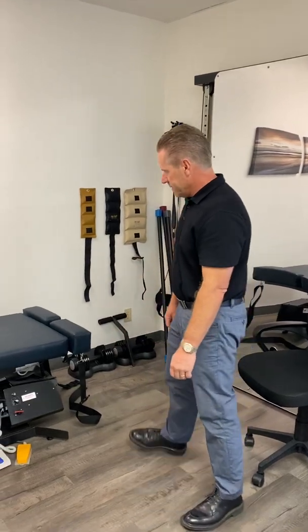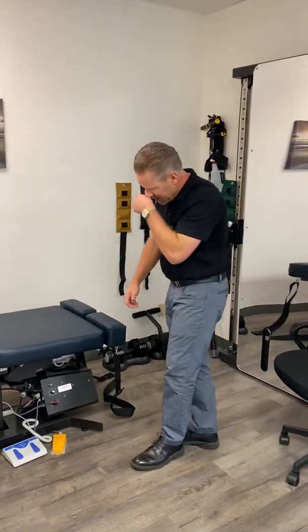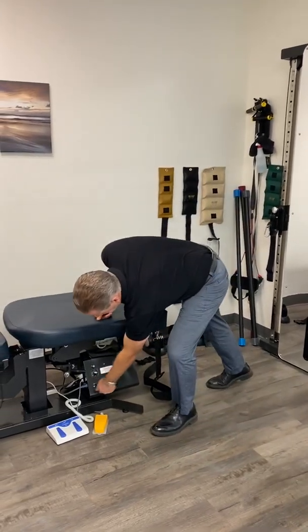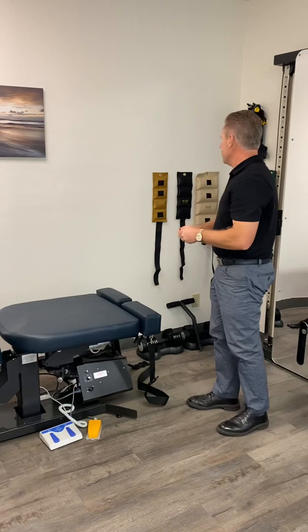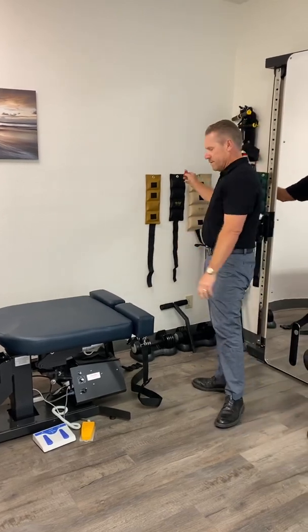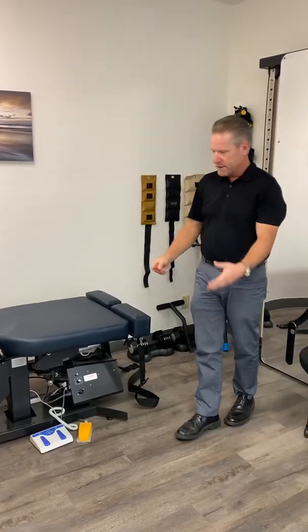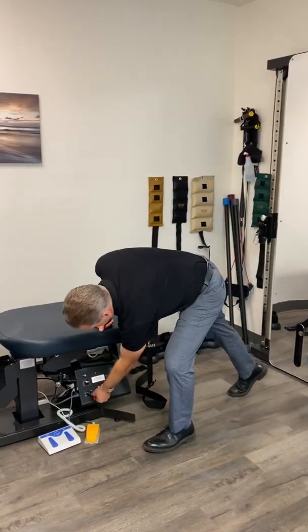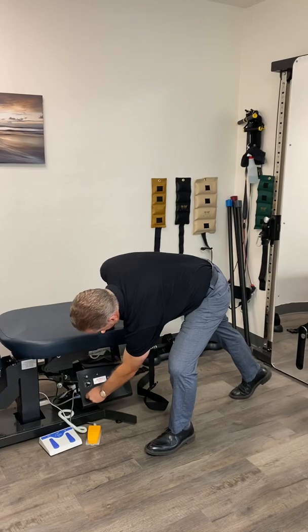The new table in the specialty center. This is potentially dangerous because it moves. So that's why it comes with a key. And so we'll probably be keeping this key elsewhere just so that a kid doesn't accidentally come in here and get hurt. But for this to work, you have to have the key on.